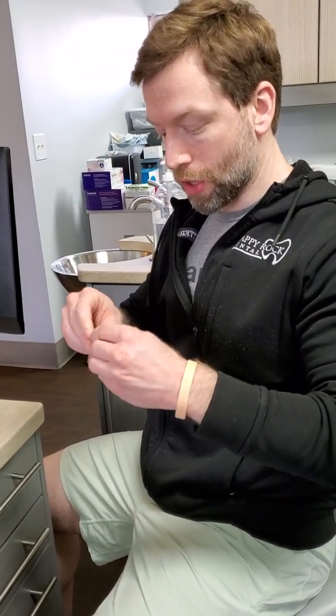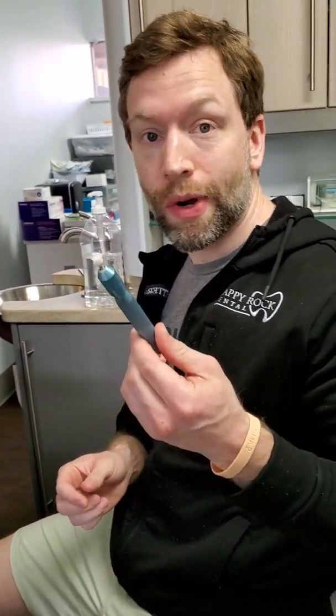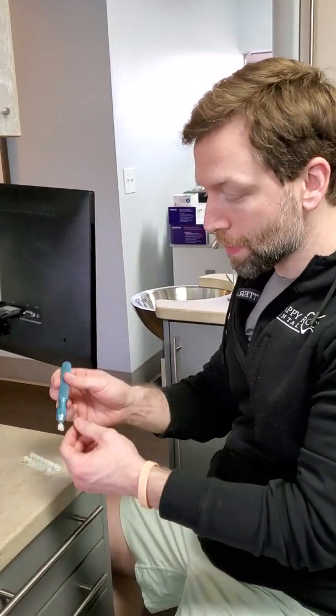So once this is cured, solid. I can then polish everything off, and it's screwed on there right now. This is all ready. Pretty darn quick — just take your tie base, insert it with some cement, cure it, and you're done. Hope that helps.